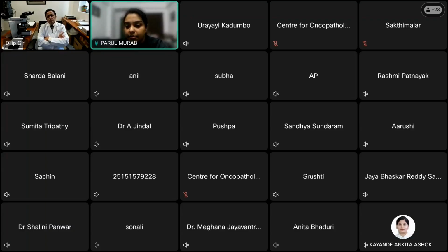So the next is, in vacuum-assisted biopsies and excisions, mostly the tissue is fragmented and the cells are scattered. So how to approach that? I think this is an inherent problem, especially with fibroepithelial lesions.